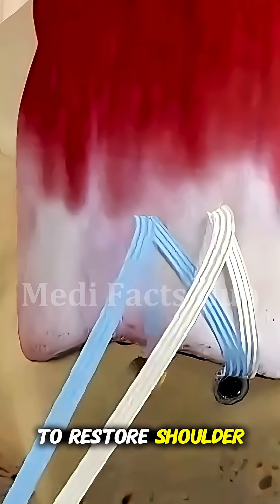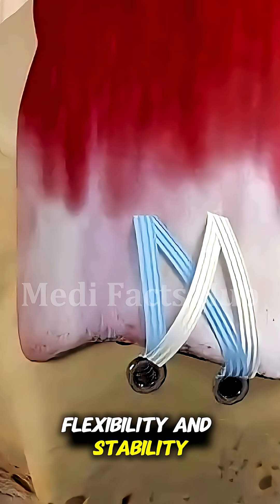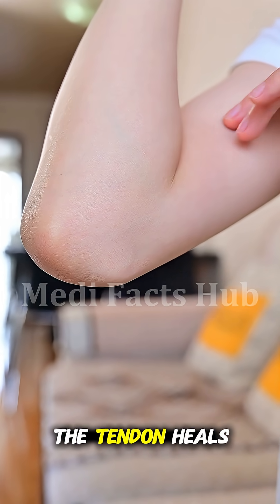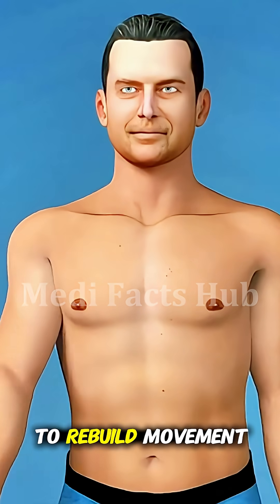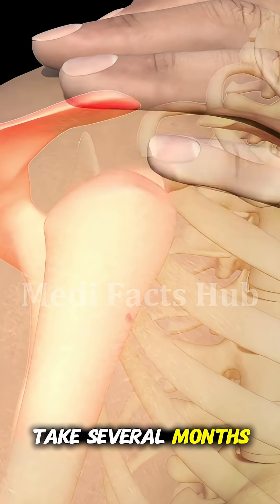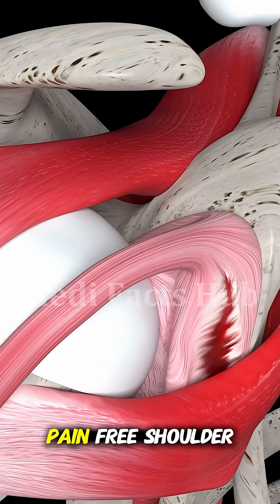The goal is to restore shoulder strength, flexibility, and stability. After the procedure, the arm is placed in a sling to keep it still while the tendon heals. Physical therapy starts gradually to rebuild movement and prevent stiffness. Full recovery can take several months, but the result is often a stronger, pain-free shoulder.